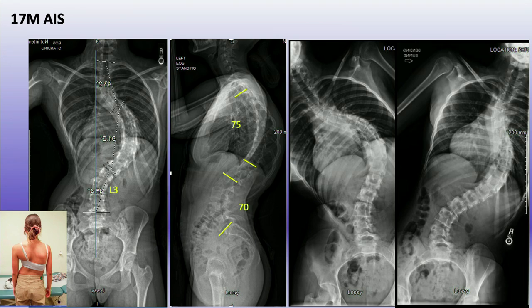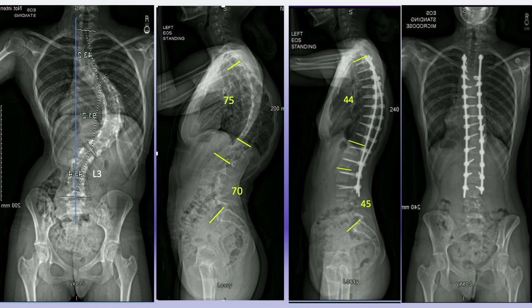This is another example — a little different because this is more of a kyphoscoliosis. In kyphoscoliosis I try to get an MRI on all those patients. You can see there's a compensatory hyperlordosis in this patient, and when you address and correct the kyphosis, the lordosis actually corrects as well.